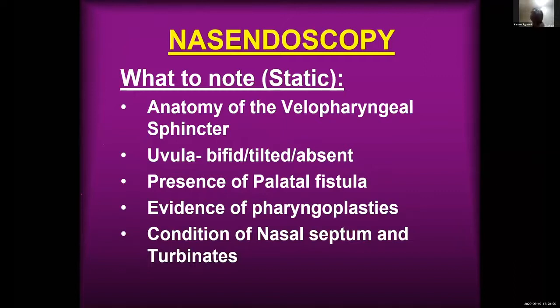So this tells us about the difference between the rigid and the flexible endoscope. As a whole, there is no difference between the two of them. Dr. Mukund has already explained about the speech and its connectivity with the pictures or video of the nasal endoscopy. But theoretically, what we should note is in two parts: one, static view, and second, the dynamic.